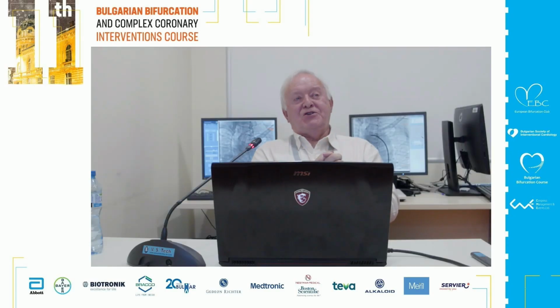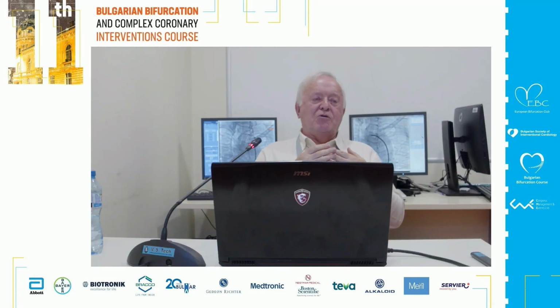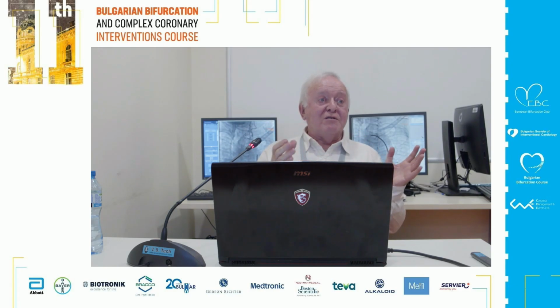So you can leave it if the vessel before stenting has not much plaque or much stenosis; nothing happens with these vessels. If you are very rich, maybe people will go with FFR. If they have an FFR of 92, they won't do anything. So personally, nearly always I'm doing a kissing. A kissing is not to treat a lesion which is not there.